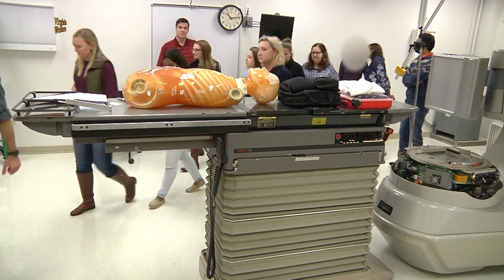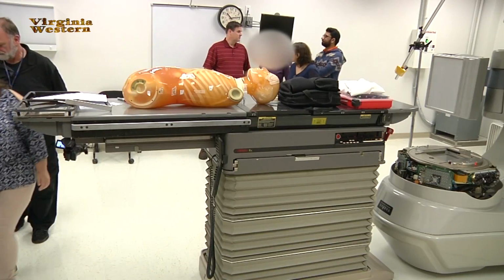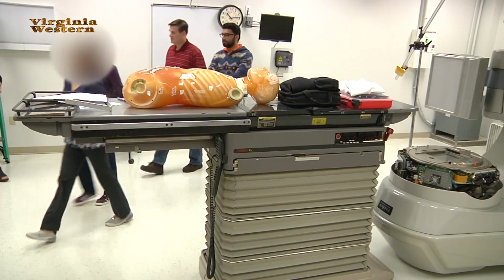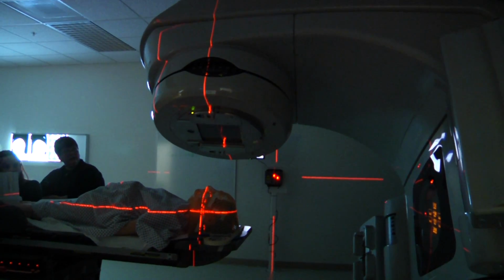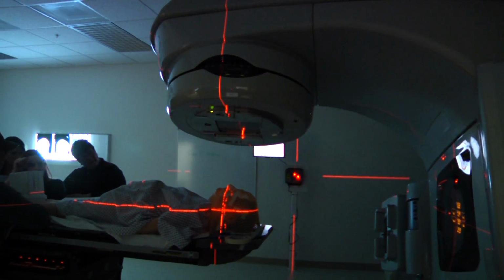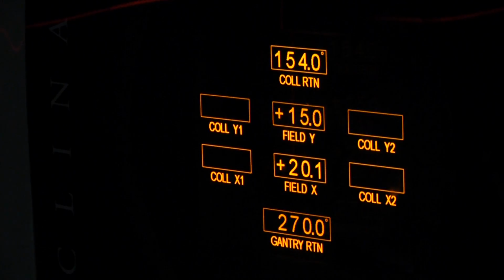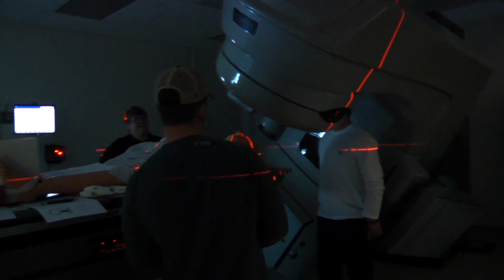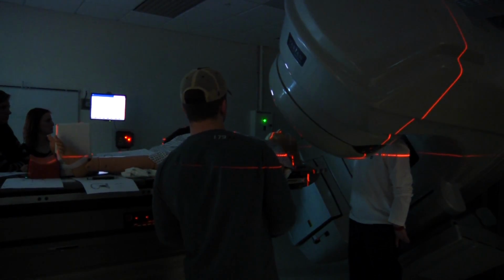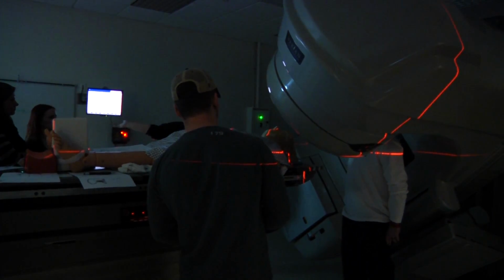A lot of the checks we do quarterly, semi-annual, annual, and biannual. And a lot of that is greasing, so your gantry bearing, that's a very precise piece of engineering. When they first started building accelerators, they used the same type of bearing that was found on a tank because it has to be able to hold that weight, but it also has to move within 1.5 millimeters. So it has to move all that weight within 1.5 millimeters. Can't have any flexing in it. Well, you need to lubricate those bearings.